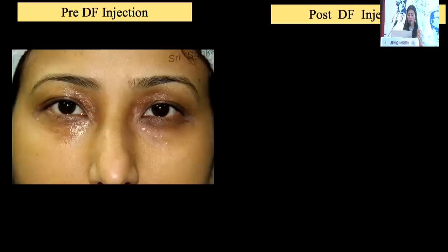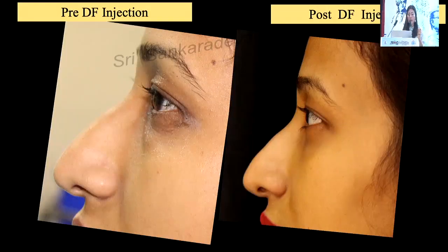And in the lady, you can see the right side is being injected. Sorry, my voice is totally gone. And you'll see the changes on the table. See, this is the right side that is injected. The fat bag is not there. The left side needs to be injected, and you can see the fat bag is much more prominent. So the results are very immediate, and you'll definitely see a change. The patient looks much rejuvenated following the procedure. And not only that, there is correction of the negative vector into a positive vector following the injection procedure.